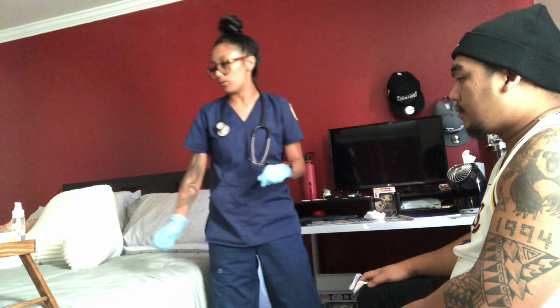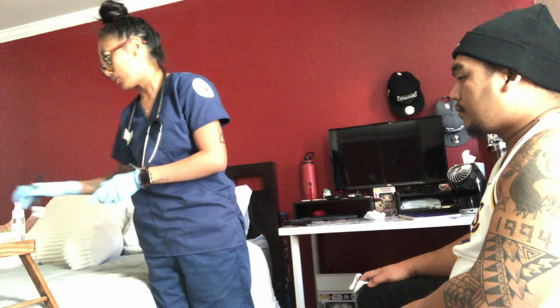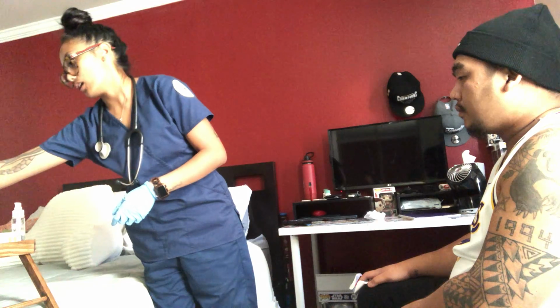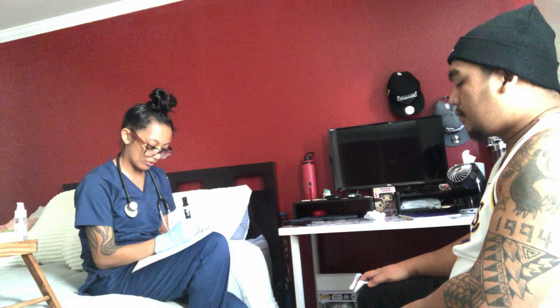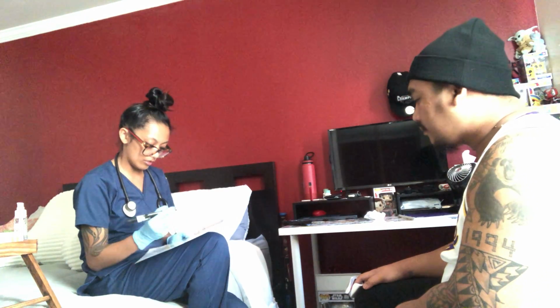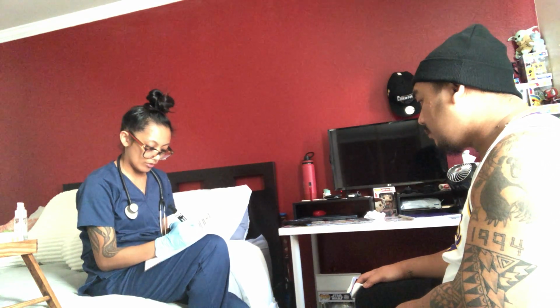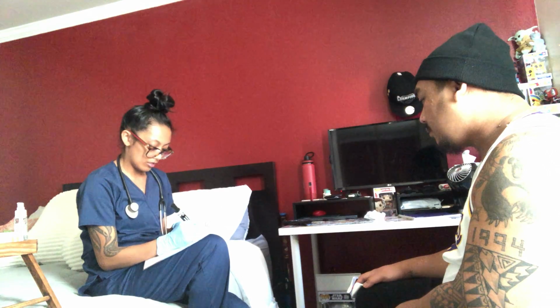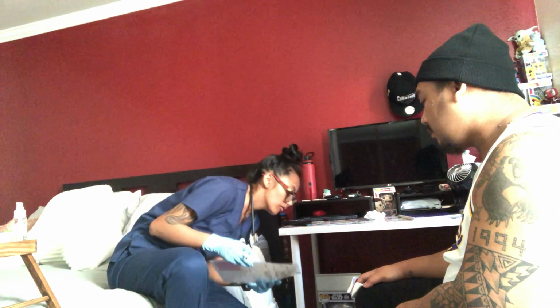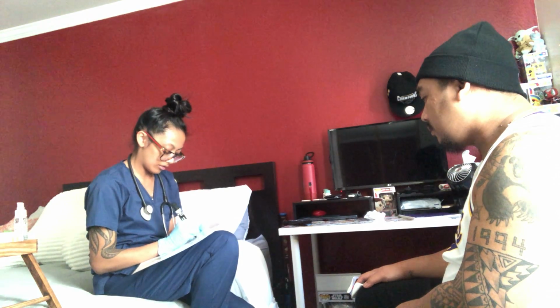Okay, so for your pulse, I got 40 for 30 seconds. I'm going to multiply that by 2 to get 80. So your heart rate is 80 beforehand. Your respiratory rate, I got 9 times 2 for 30 seconds to equal a minute is 18. And then your O2 is 98.